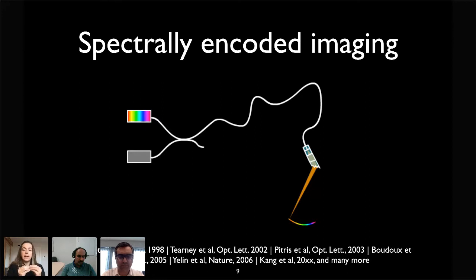We started by dreaming and said, what if we had a laser that was changing in color very rapidly in time, and at the tip of the fiber optic, we put a prism. From Newton's experiment, if we put in a prism, the prism will change the location of the light. And if you have a laser scanning in terms of wavelength, you essentially have a scan onto your sample. Of course, this is the ideal picture. The laser did not exist, and a prism does not deviate enough. So we went with a diffraction grating.